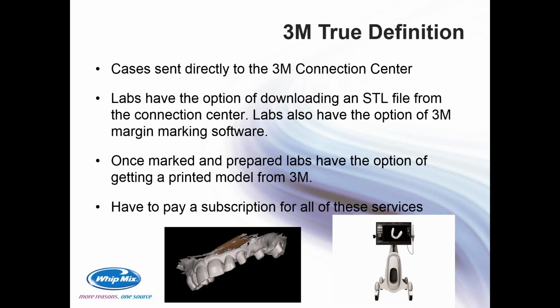With that being said, if you have a doctor that gets a 3M True Def scanner, for the first 30 cases that they send, you're actually paired with a margin marking lab that marks the margins for you. And then once you've gone through those first 30 cases, you are then eligible to start marking the margins on your own.